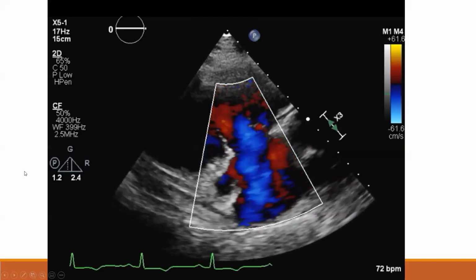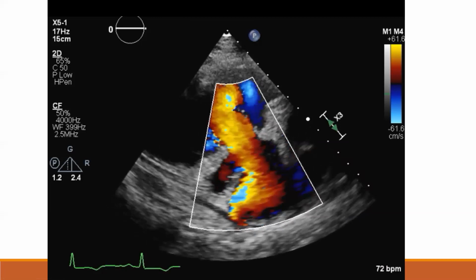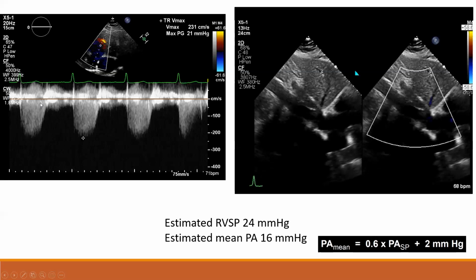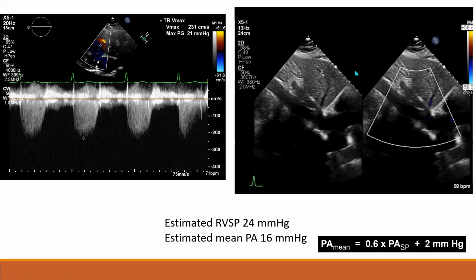The TR, that's the pre-image. The TR also got better. And if we look at her RVSP at this point, it's also normalized.